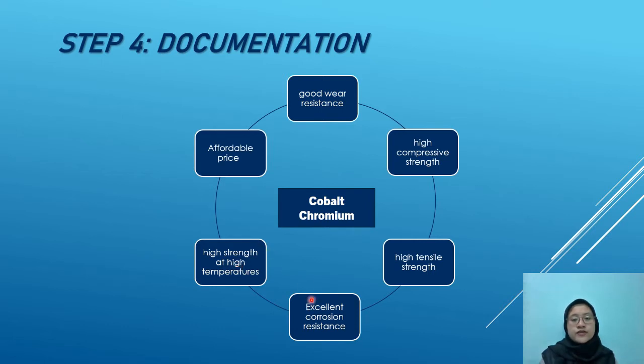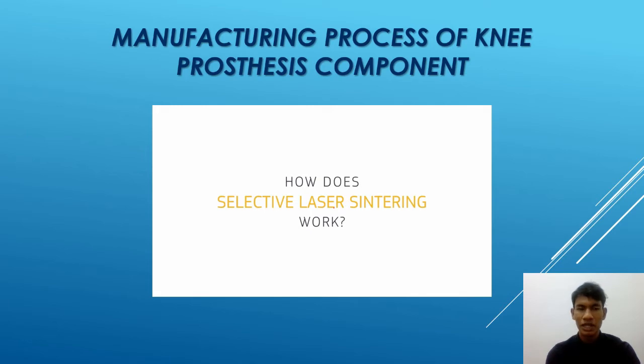Then we have excellent corrosion resistance that will withstand corrosion, and the cobalt chromium alloy also has an affordable price to be used as the material of the knee joint implant. Hi, my name is Muhammad Naim bin Abdul Rahim.